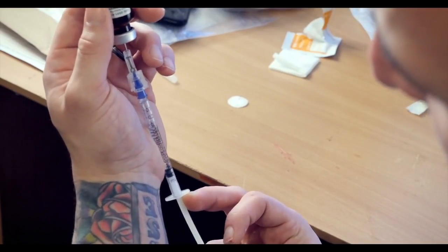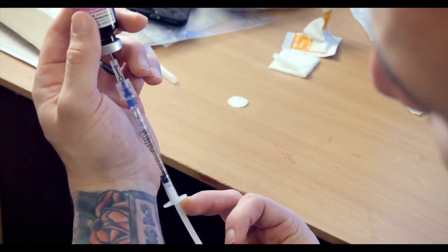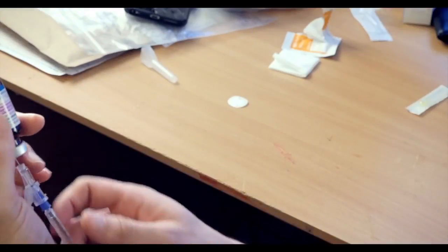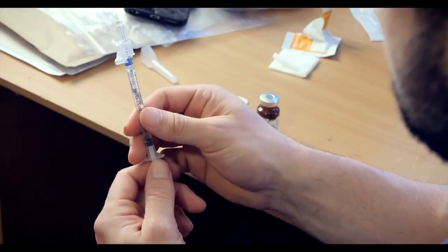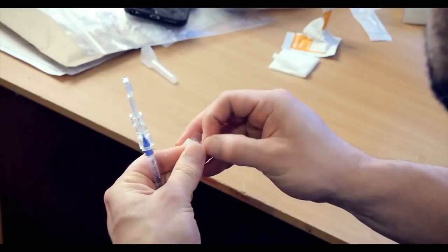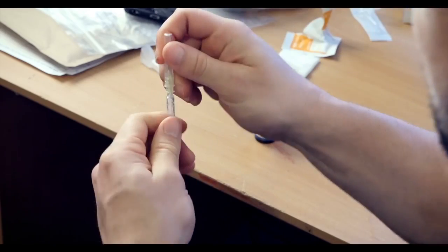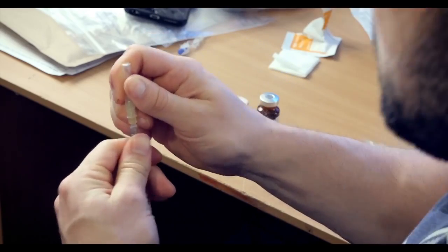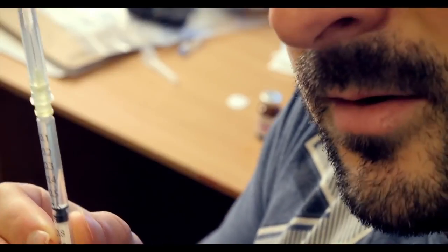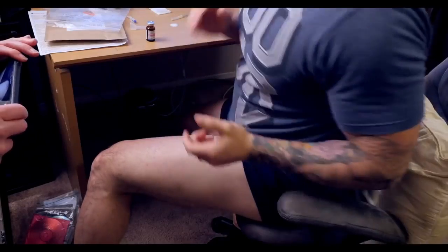I can see we're coming up between the 0.3 and 0.9 markings. I'll go a little bit over what I actually need because you inevitably end up losing some every single time. I pull that out, secure that needle, get my other needle ready, pull this one off, put this one on, and secure it tight — I might even use the table to tighten it. We're right around 0.6 and it's time to inject.